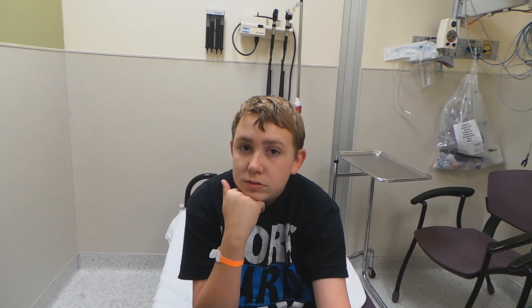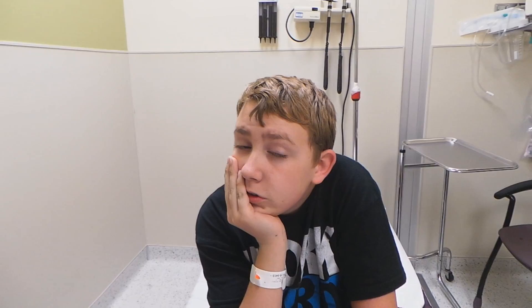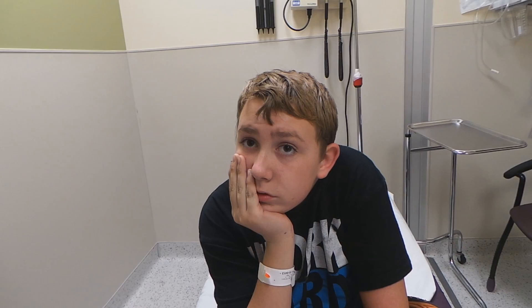This young man is here today because he's got a foreign body — an eraser from a mechanical pencil, right mom? Yes. He's agreed to be on video and he knows it's going to end up on YouTube. So you put an eraser in both ears, right? The nurse at school was able to get one of them out, but we still have one in the other ear. We're going to give you some medication to sedate you because you're kind of anxious, and then we're going to go in there and gently remove that eraser.